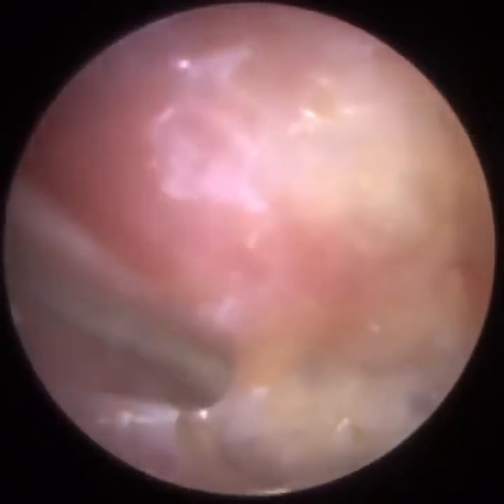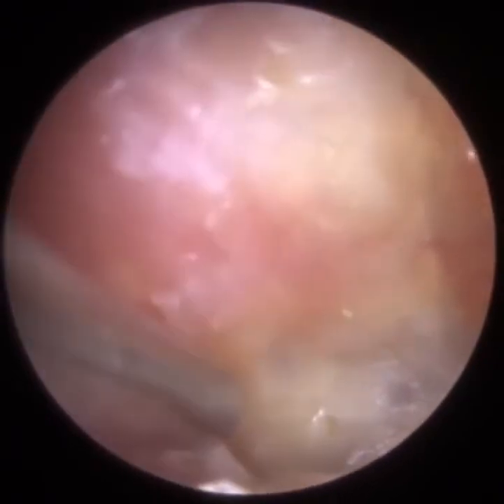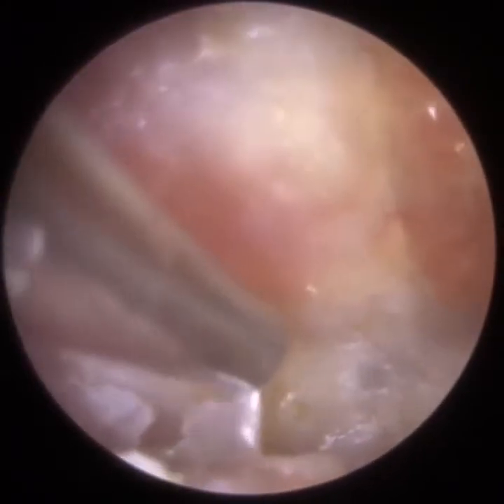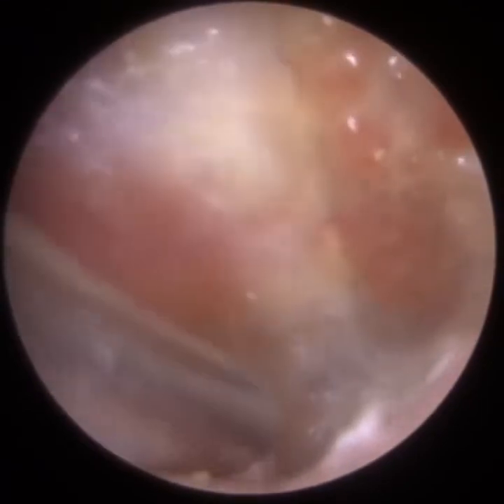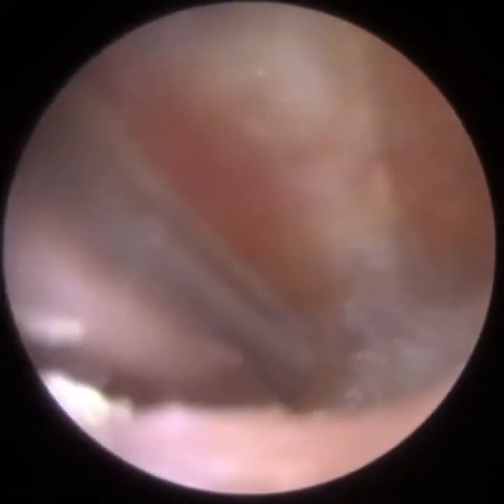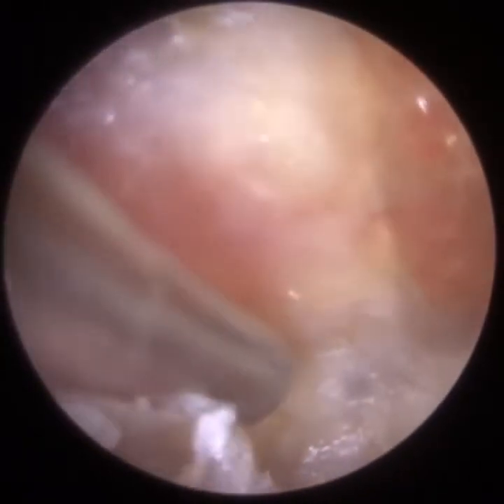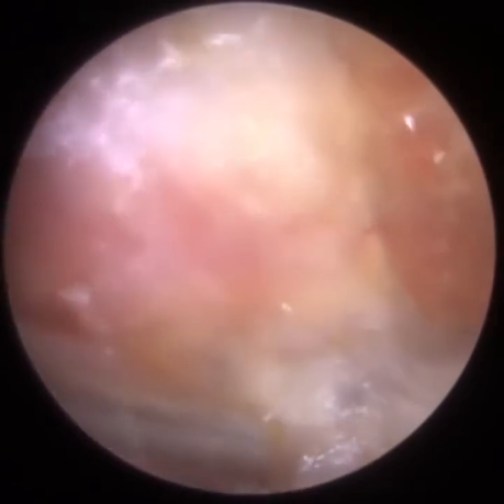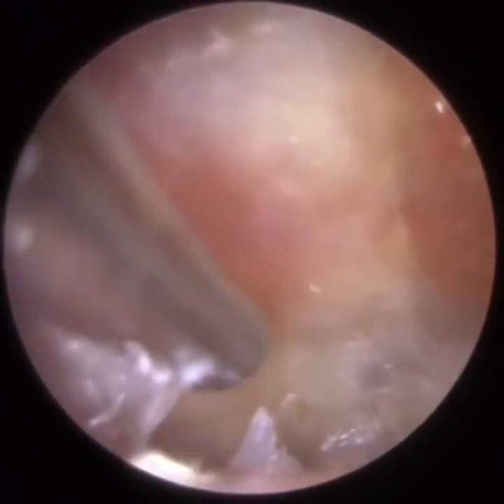So again, we've got a really zoomed in view of the eardrum, great magnification on the anterior part. I'm just trying to peel the skin away from the eardrum now, from left to right. This part of the eardrum is still slightly damp, so I'm going to hover the fine end directly onto the eardrum just to suction any moisture off it. Look at that view, you can see the whole eardrum there in one view. That's the benefit of an endoscope. That's the field of view it provides.